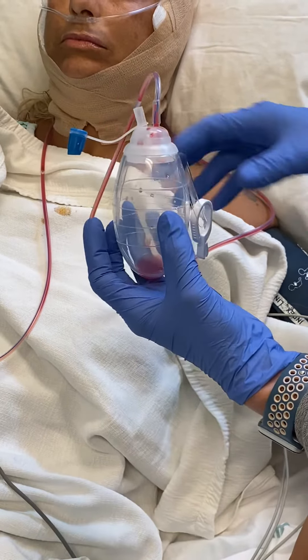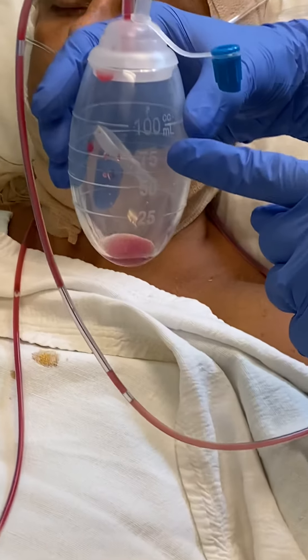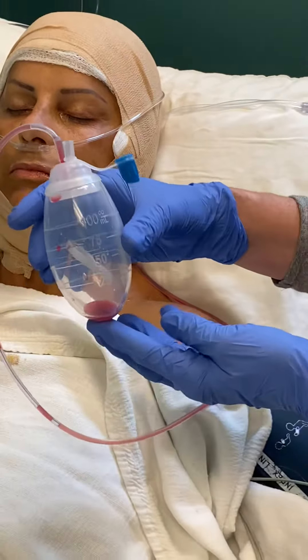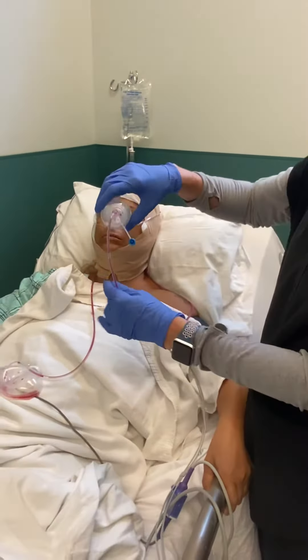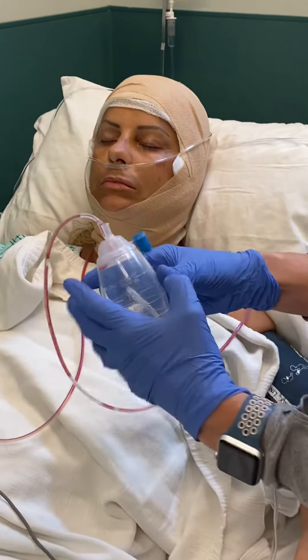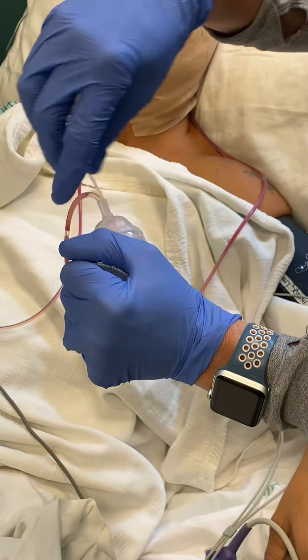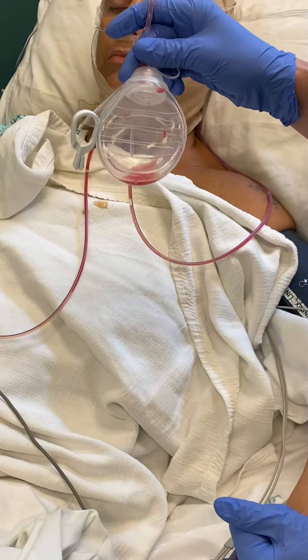You can see here there are little numbers so you can kind of gauge what's in there. There's really nothing to empty right now, but we do give you a little cup. If it were about up to here, you can turn it up and squeeze it out, pour it into that cup, then turn it back and just push down with your hand to get all that air out, and then turn it back on — and now you can see it's working again.